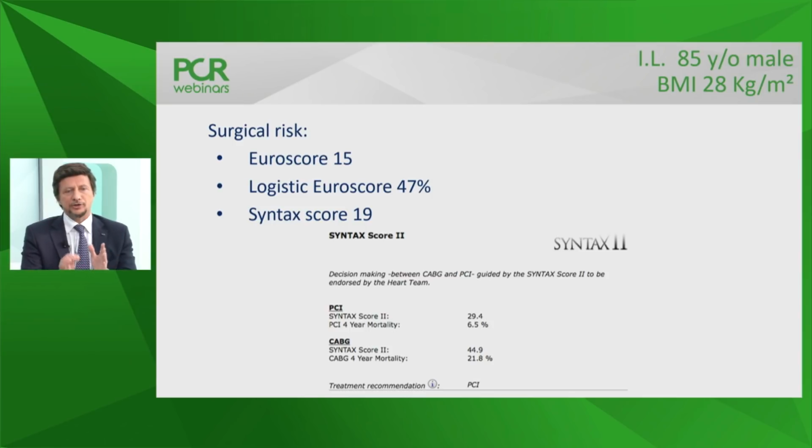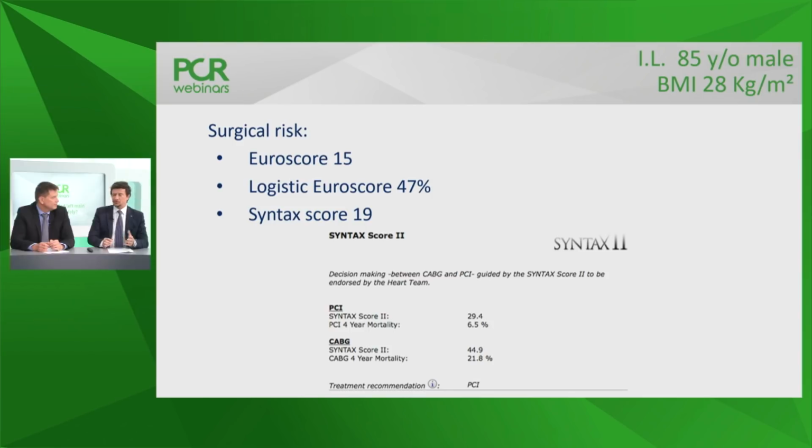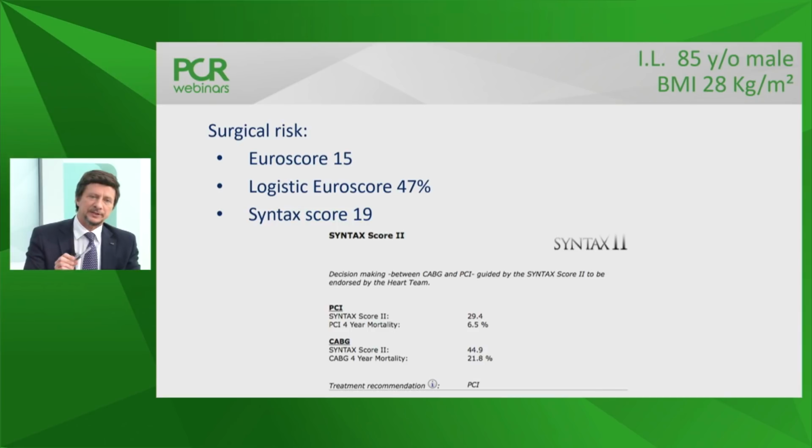On the other side, the angiographic analysis shows a very low syntax score, which makes this patient apparently a good candidate for PCI of the left main. But I'm convinced that this angiographic evaluation of this left main underestimates the risk that might be behind this extremely calcified bifurcation, just because the lesions are short, the vessels are big, and the distal vessels are good.